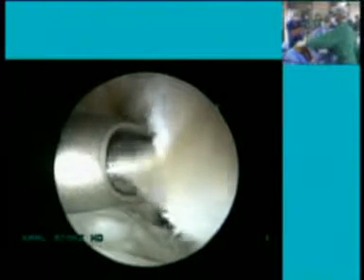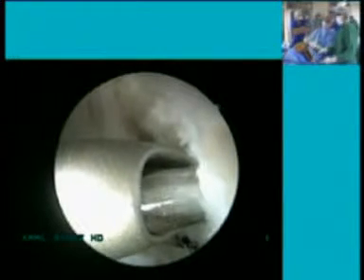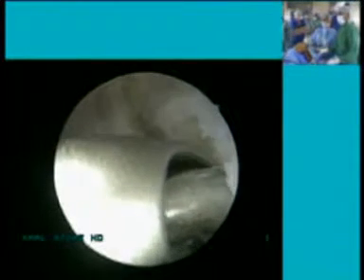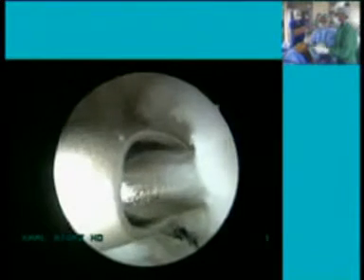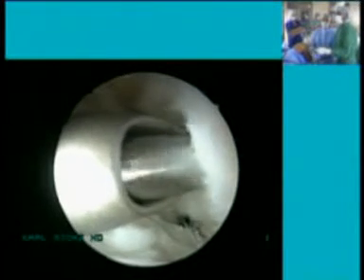So you like to keep the slot facing towards you? You can use this aimer in any direction, so yes, you would like to keep the slot facing towards you straight. Yes, if your knee is flexed more than 110 degrees, that should be okay. Drill, please. All the way through, thank you. No. Let the drill guide drill in, please. Go out.